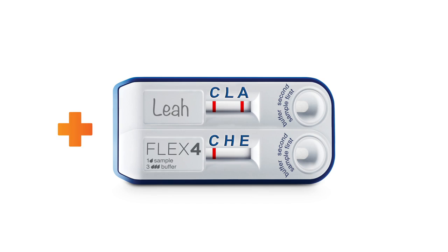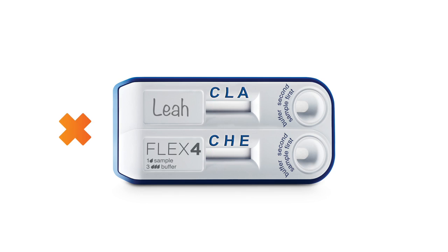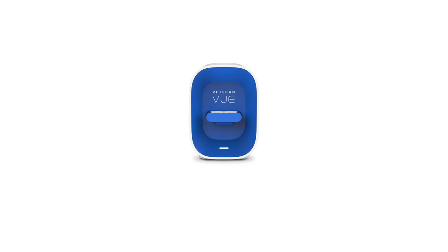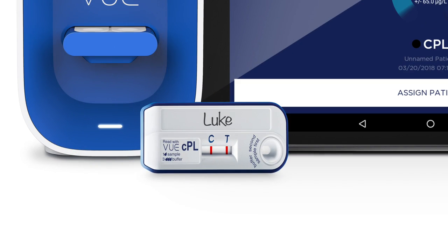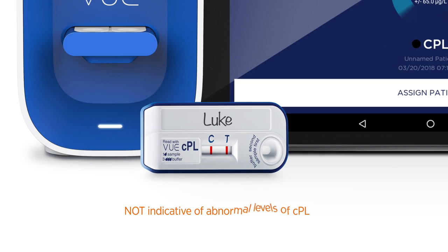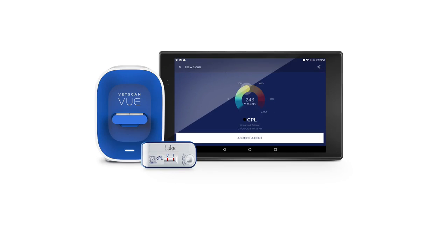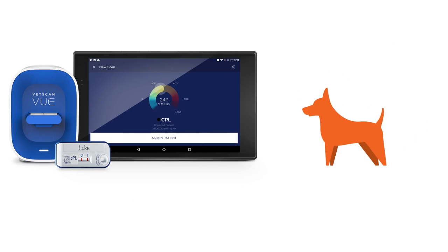The View interprets a test as negative when only the control line appears and no test line is visible. If no colored line appears at the control line area, the test is invalid. The VetScanView is required to interpret the semi-quantitative results of the VetScan CPL RapidTest. A visible test line on the VetScan CPL RapidTest is not indicative of abnormal levels of CPL and may appear even in normal or healthy dogs.